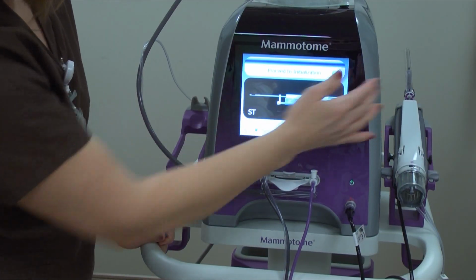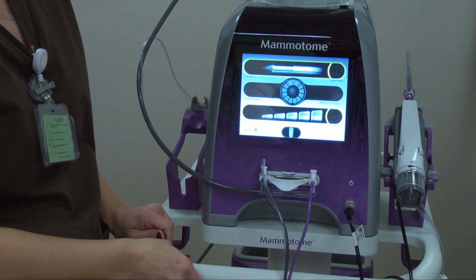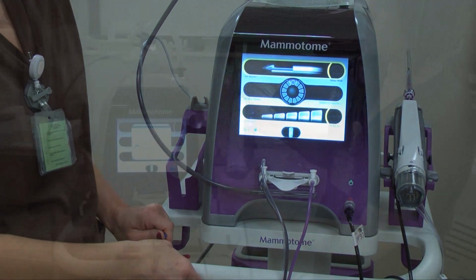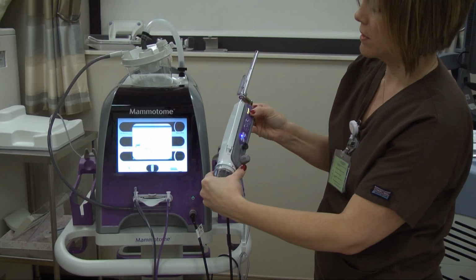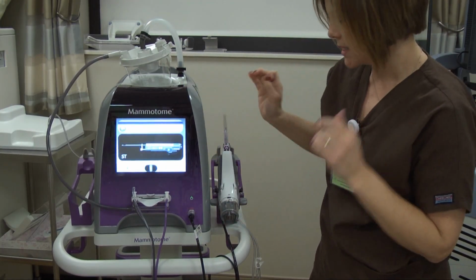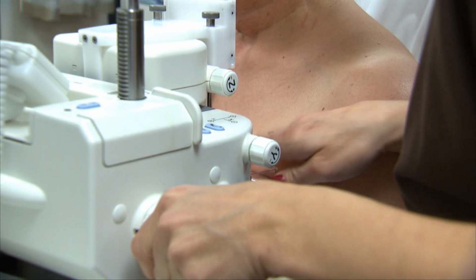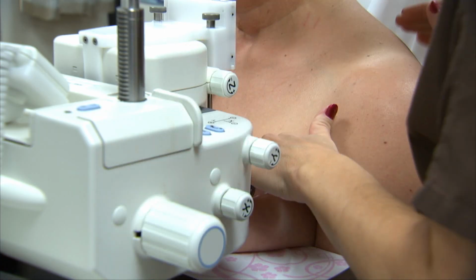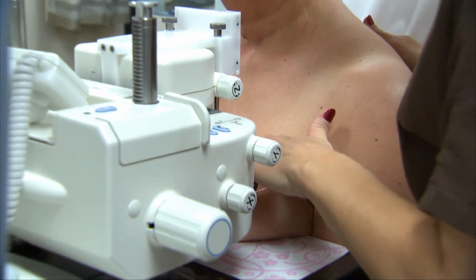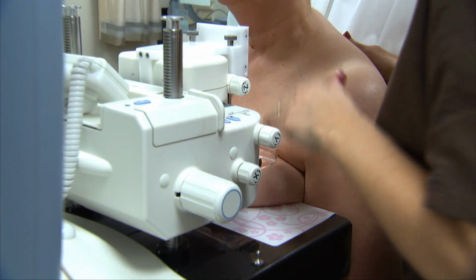Procedure initialization begins. So you do this for every case before the patient is ready, is that correct? The holster side is selected, and the machine is put on standby. The patient is positioned in a craniocaudal position with her left arm down at her side. Compression is applied against the left breast. The first series of scans are taken.